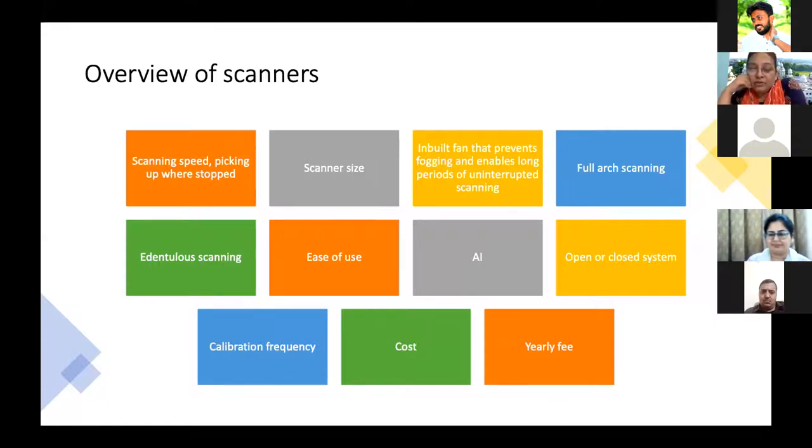We were also looking at a scanner which is open, not a closed system, meaning it could be applicable to any software. We were looking at a scanner which doesn't have a yearly subscription, otherwise it becomes very expensive, and maybe we don't have that much funding every year, and purchasing such equipment would be a waste. So we wanted an academic version with a permanent license, so once bought, it can be used for a lifetime. Then ease of use.